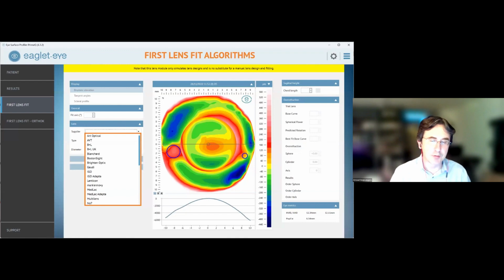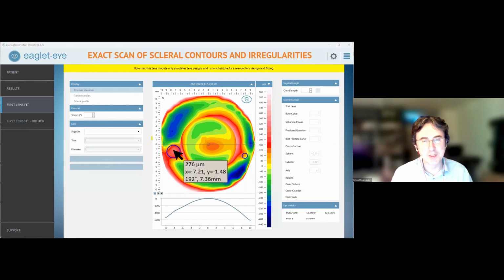And of course, there is a growing number now of highly customized lenses connected as well, that just take the 3D data measured of the eye and then create a personalized, customized lens on that. And so, this is really keeping the improvement going forward.